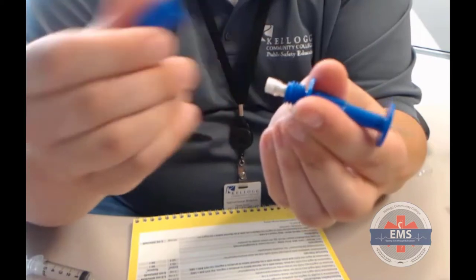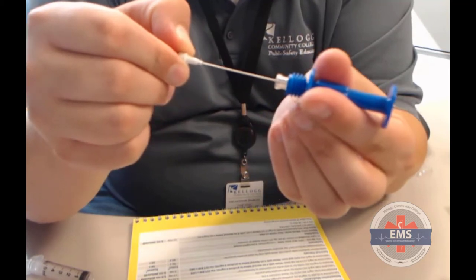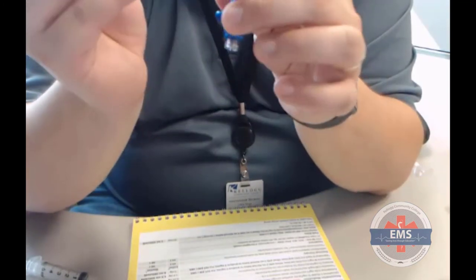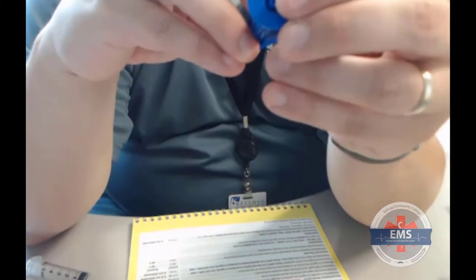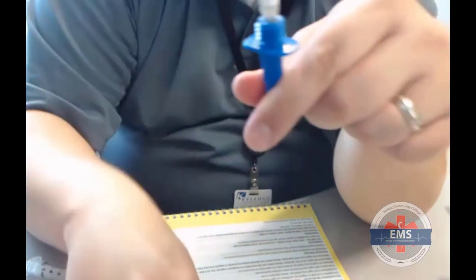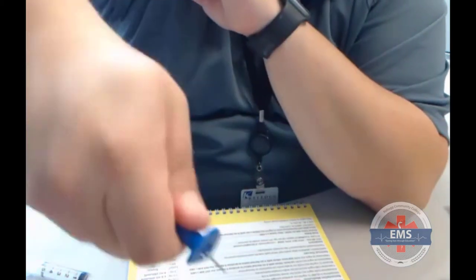Here's your cap. That cap will come off when we're ready to infuse. Here you can see this is actually our stylet. It's just a solid metal rod that fills that little hole in the bevel. And that's important because when we put this into the bone, we don't want that center canal filling up with bone, because we won't be able to infuse through it. So making sure that cap is on and screwed on tightly becomes really important because it helps make that canal as we drive it into our site.